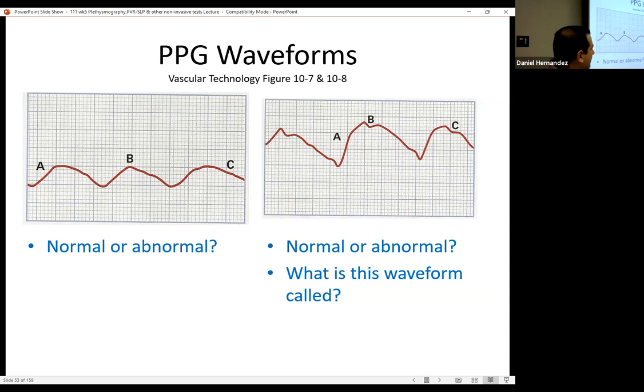No, because that really doesn't have a notch on the anterior side of the peak, right? So the high notch would indicate Raynaud's. But if it's on the other side, it's still the same, right? If it's the anacrotic notch, that also indicates Raynaud's. Yeah.